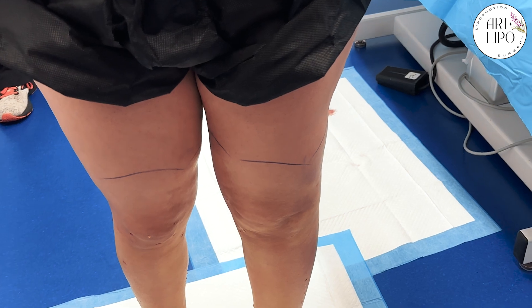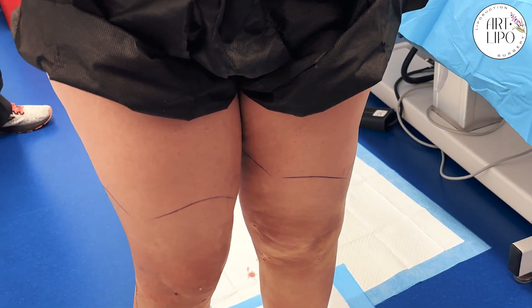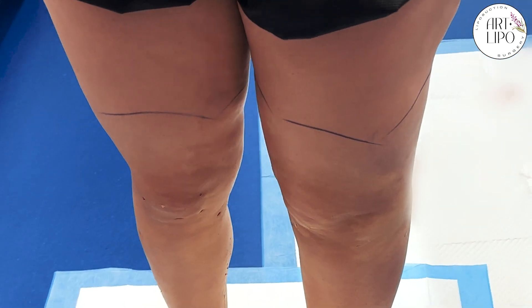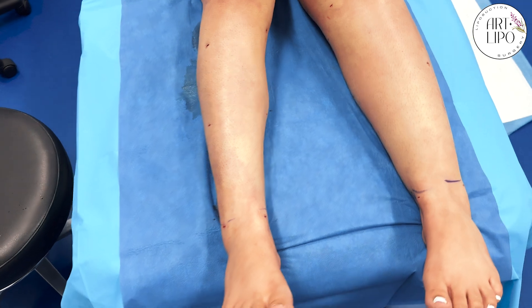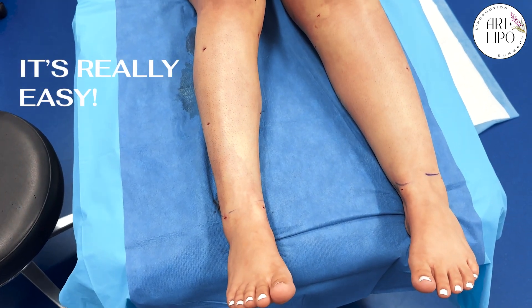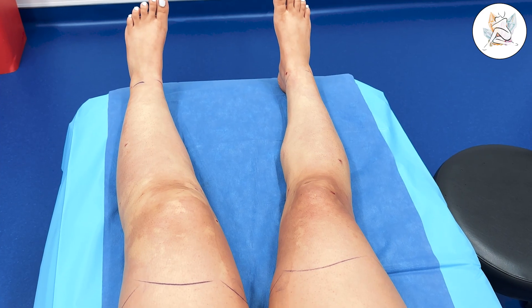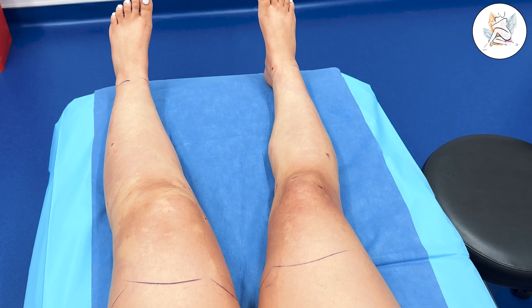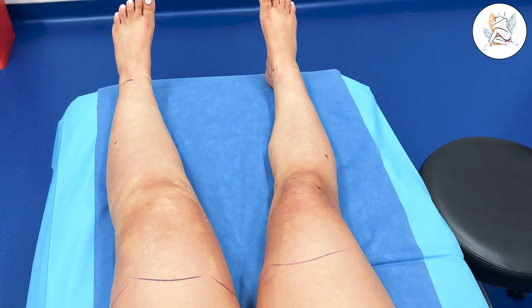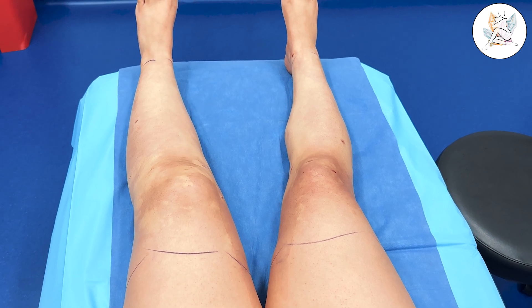Let's talk about the sculpting part — the removal of the fat. How was that? That was a lot better. You do feel a little uncomfortable here and there, but it's honestly really easy. People oftentimes say that after the fact, but she was reacting during certain parts. Maybe 10 seconds here is really stingy and another 10 seconds there, but for most of it, it's pretty good.